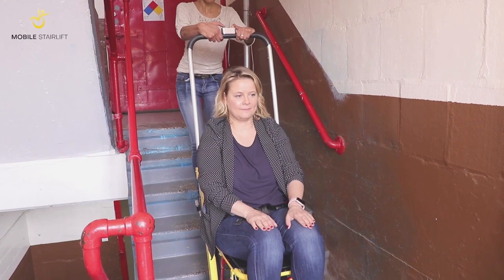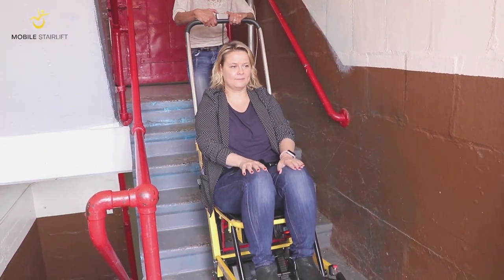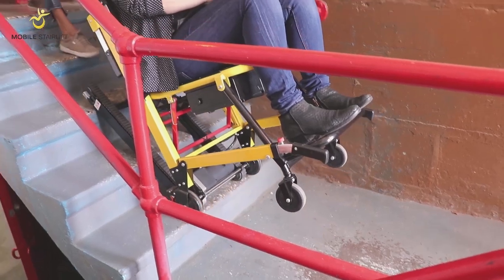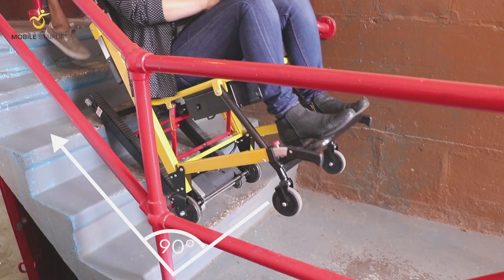When you are ascending or descending stairs, always make sure that the tracks are sitting flush against the stairs, and that you're always climbing at a 90 degree angle to the direction of the staircase.